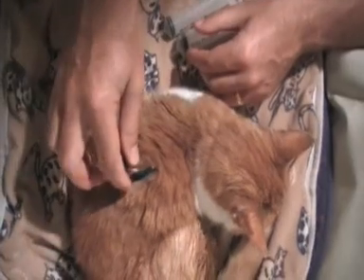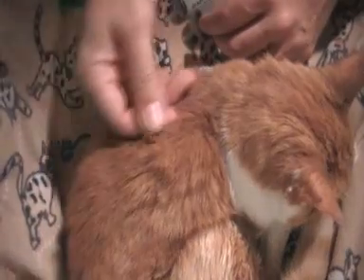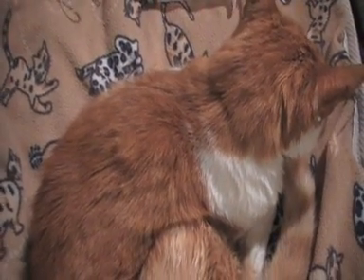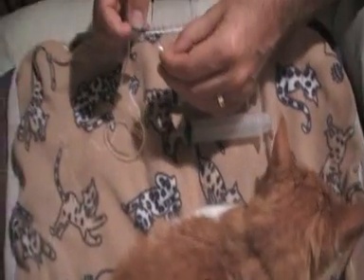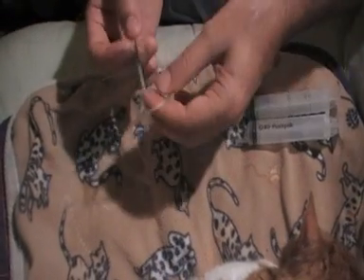60ml of warm fluids under the skin. Slowly pull the needle out, and there it is. You can see a slight raising of the fur there — and that's it. Put the cover back on the needle for safe storage, for when we throw it away.